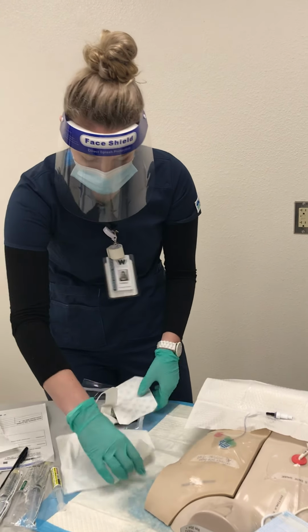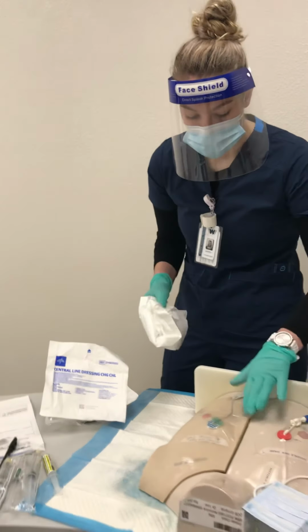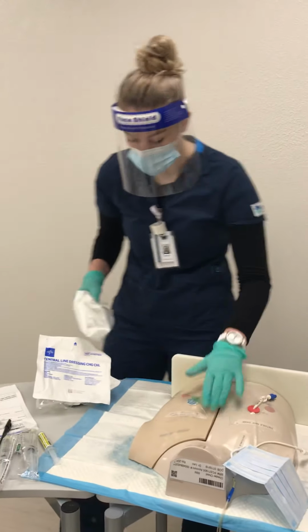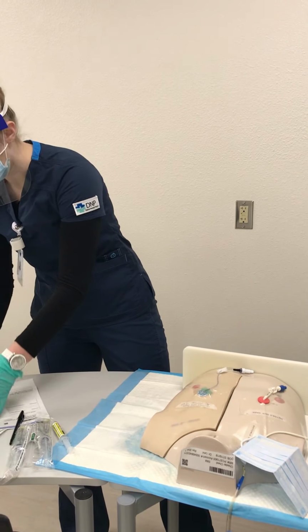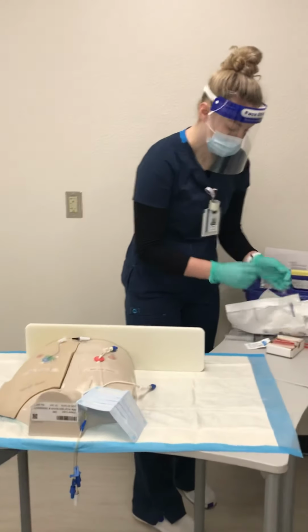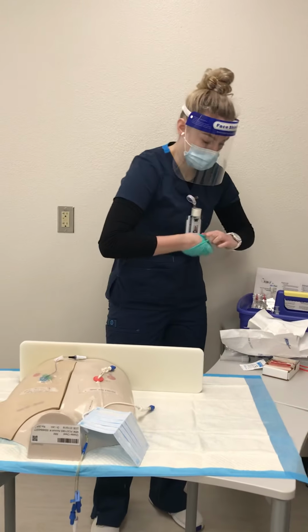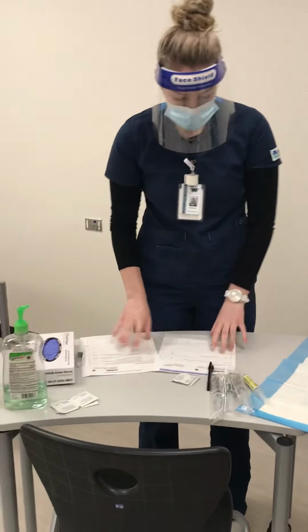So now that the dressing change is complete, I can clean up my workstation. And I make sure the dressing's intact and, like, I've assessed the site and everything like that, and I would document afterwards as well. So I'm just going to clean up my workstation quickly and perform hand hygiene.